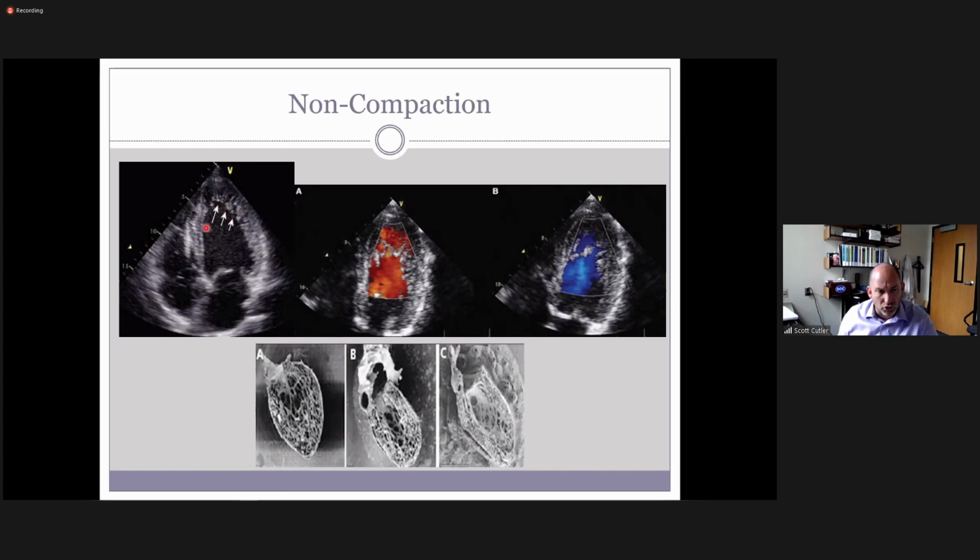And as even what you've scanned so far, you've noticed around the LV apex there is more trabeculation going on, but there are more ridges on the tissue than actual, floating out in the fluid type. So if you're getting these sinusoids that go into the muscle, you should pay attention to that and see if you can get blood flow into it.